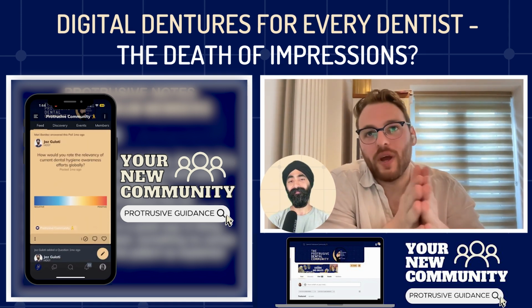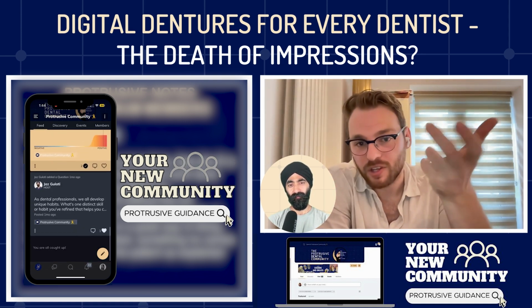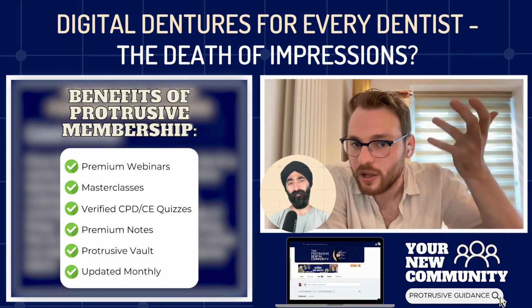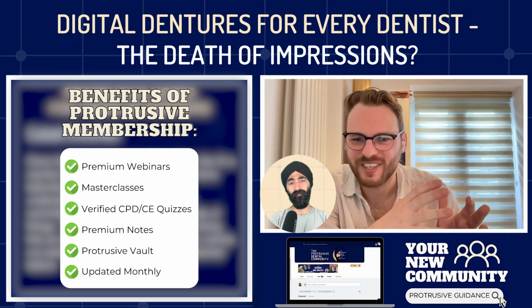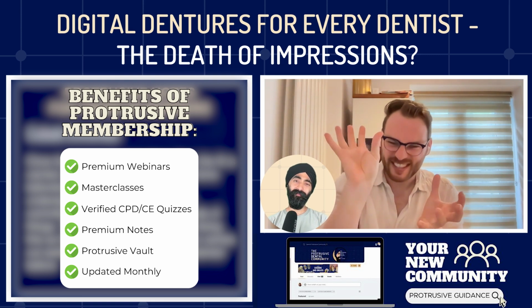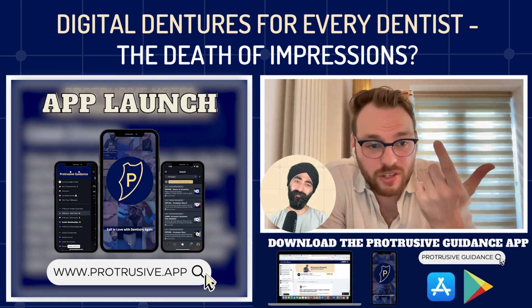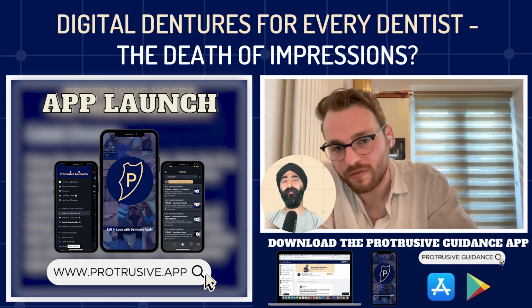So that's where, when we've done our verifier, we'll just do a verifier that clicks in on its own, so I can see everything nicely, and then we have a separate wax try-in that goes in. You can combine them together, but you're sort of doing neither job well at the same time. I'd rather have my verifier, a bit like an implant guide with windows, so you can see that it's seating fully. Then you do your chrome try-in just on its own as a framework, and you've already verified the bite, etc., so you can go straight to fit.